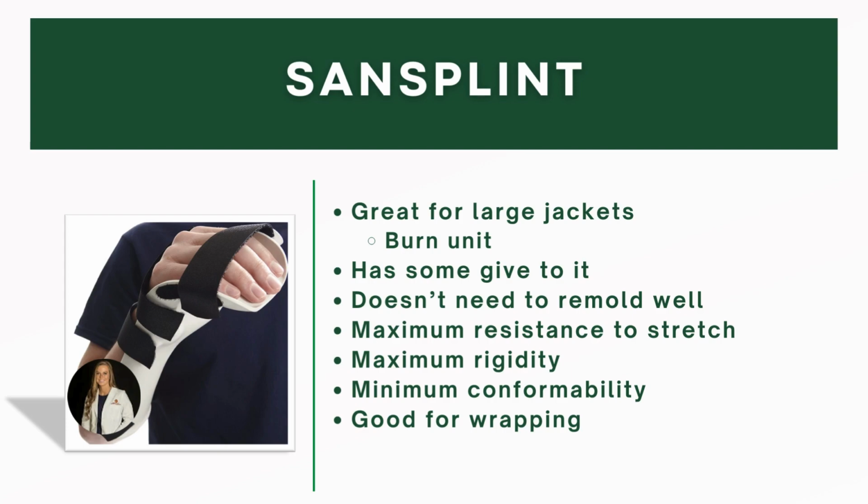It has maximum resistance to stretch. It actually has the highest, which means it has great rigidity but low conformability. So it's able to take on repeated stresses very well. This is also good for somebody who is new to splinting because you can work with the material aggressively, and those fingerprints still won't be shown.